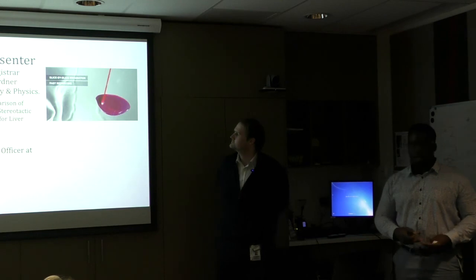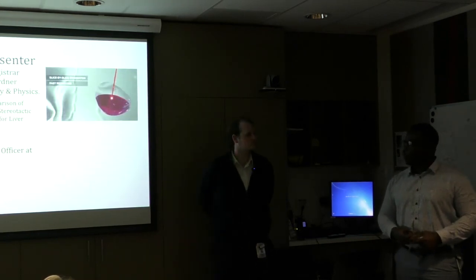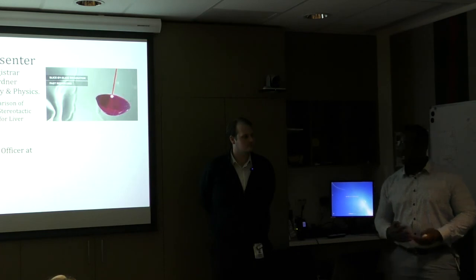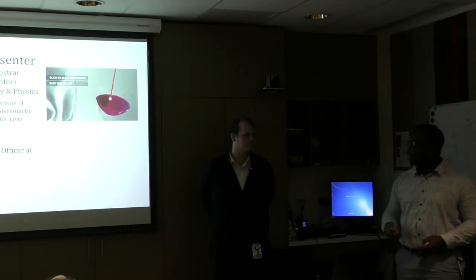Basically, it was a treatment plan comparison of proton and cyberknife for liver cancers. So I had to use Slicer to evaluate treatment plans. So my application of Slicer was directed towards radiotherapy, treatment plan evaluation, and comparison.